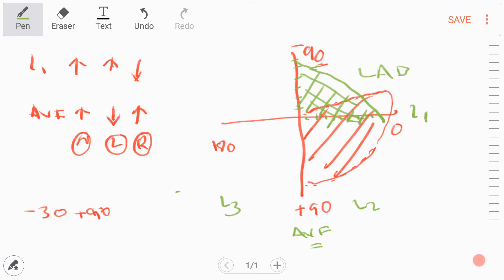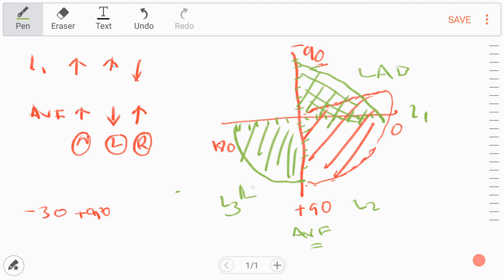To look for right axis deviation, Lead I has a negative wave and AVF has a positive wave. Mark the positive AVF value going downward, and Lead I is going to be negative, so mark it in the negative direction. Where those two values meet on the diagram will show you the right axis deviation. Using this method with small squares gives you a good idea of where the axis lies.